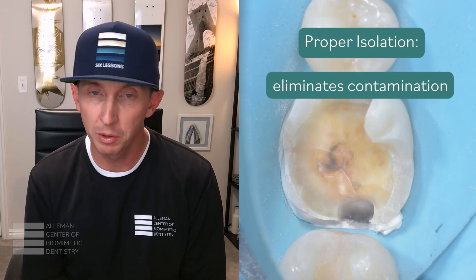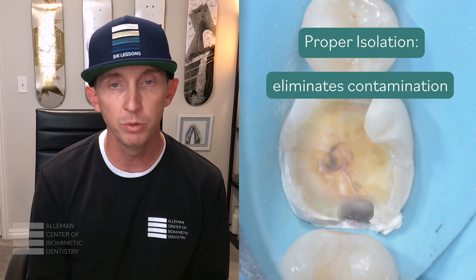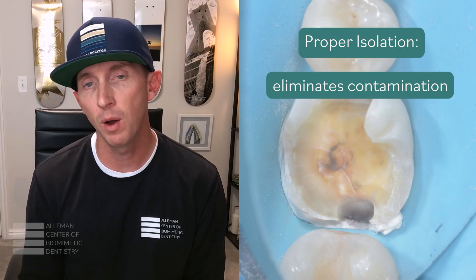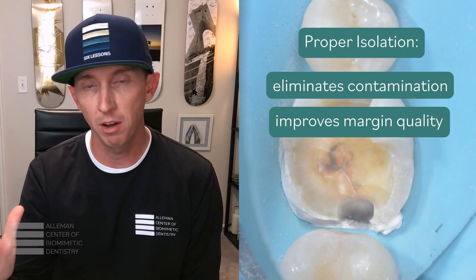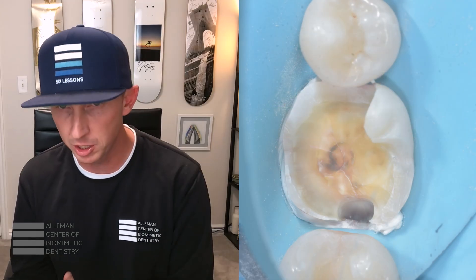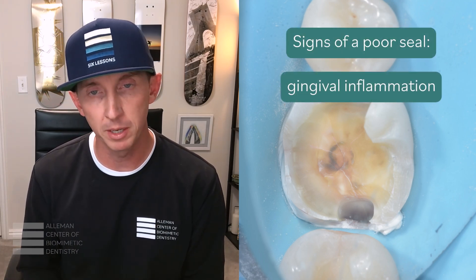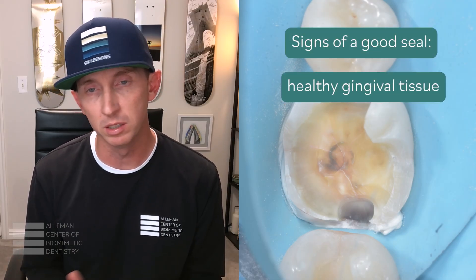As we rebuild these areas where we've dissected a fracture, removed decay, or removed an old leaky restoration, we can now have complete control over our marginal quality and also ensure that we have a good seal. How you fill these defects can determine whether you have gingival inflammation — some kind of chronic inflammation of the gingival tissue — or if you have something that begins to heal and create a long junctional epithelial attachment.